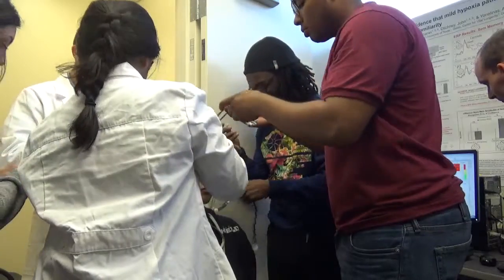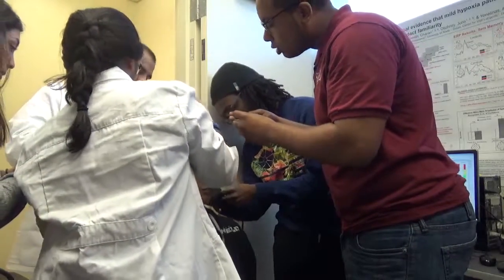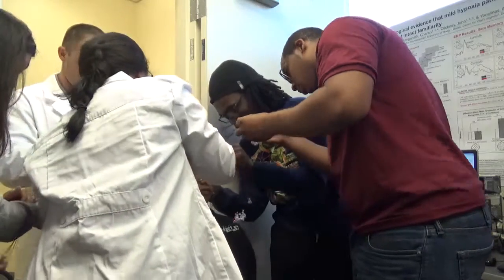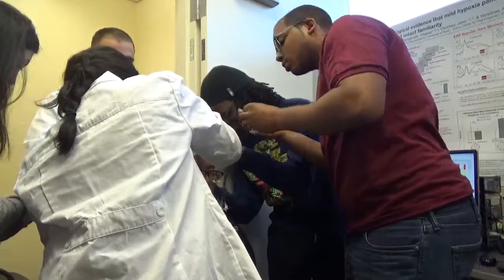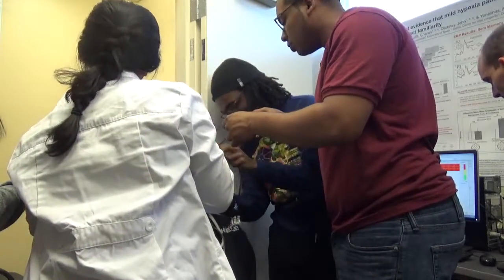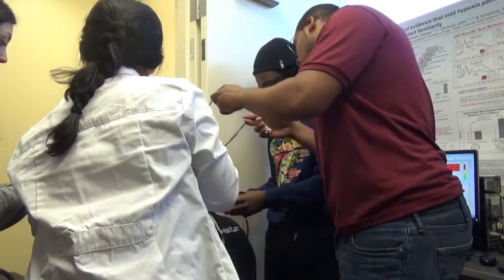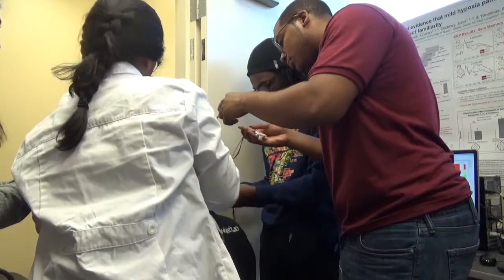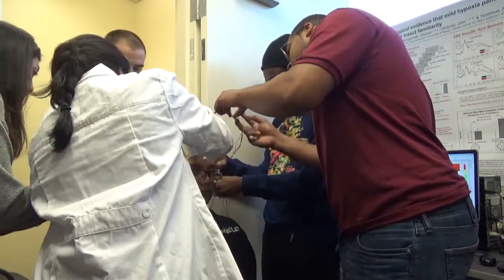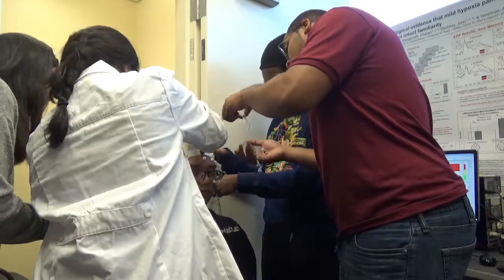Is there certain alignments? Well, the alignment is just number to number. It's got to be the right number. 26, 26. And good question actually on alignment. It's not going to affect the data, but it's helpful if you align it so that the wire comes back towards me, towards the back essentially.